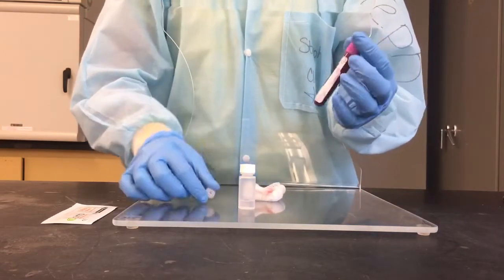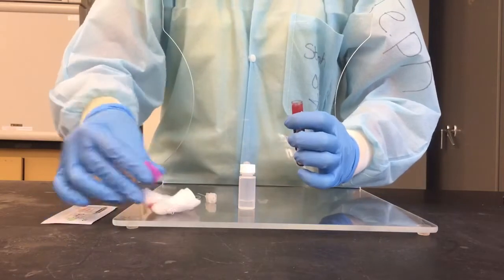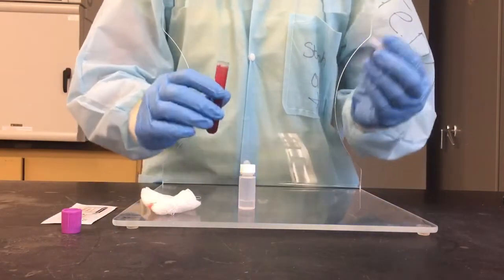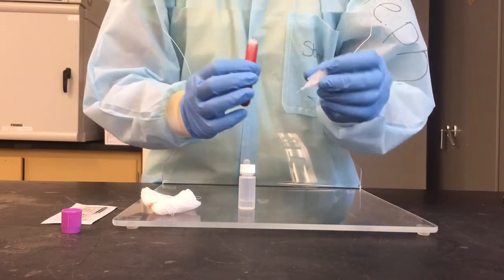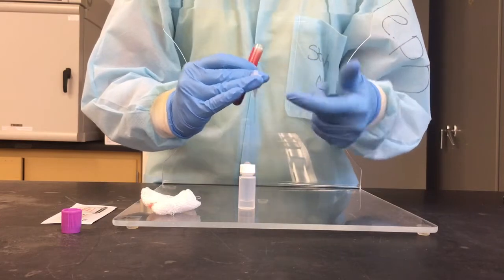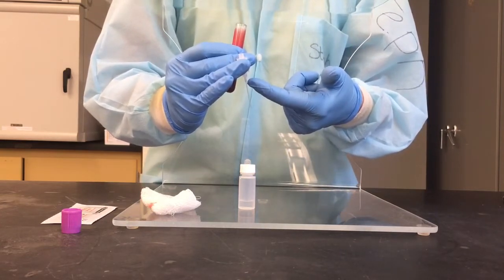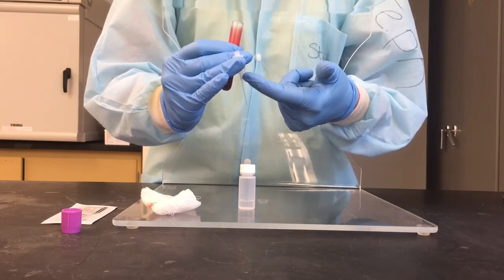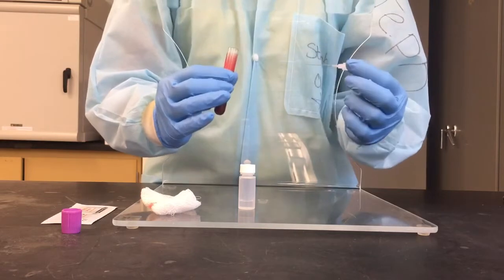Take your tube of well-mixed blood, and behind your shield, uncap your specimen. And then remember, hold your tube horizontally. This right here is going to act as your capillary tube. You're going to fill this tube with 20 microliters of blood, and it will fill automatically. There's sort of a fill line at the end where it starts to seep into the upper assembly. And so it will fill to that point, and it will not fill any longer.